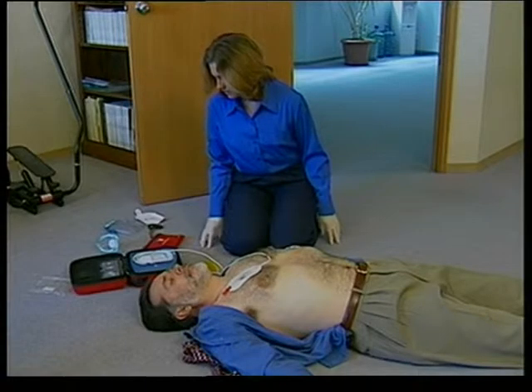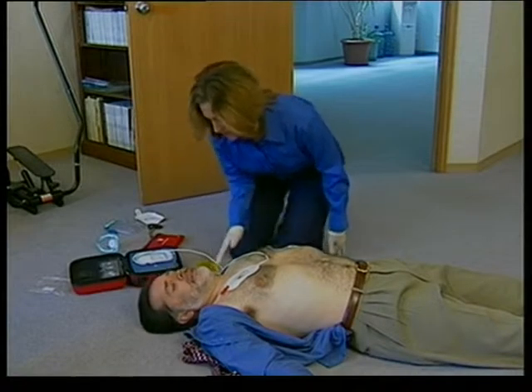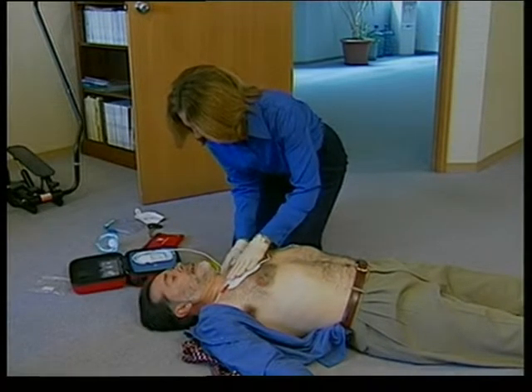Shock not advised. Be sure emergency medical services have been called. It is safe to touch the patient.